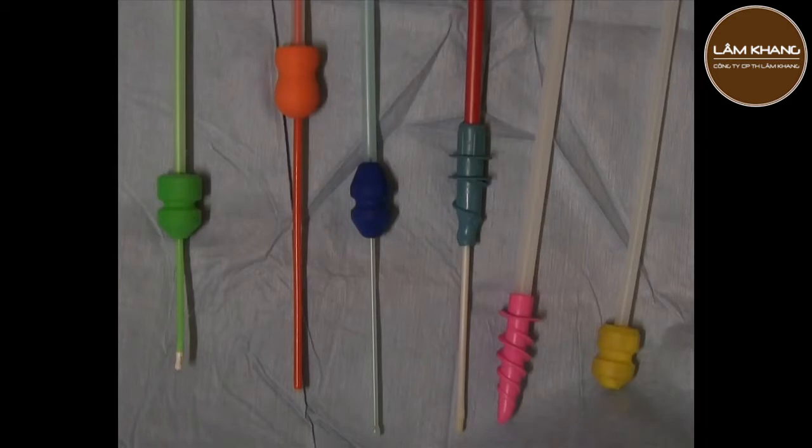Here's a picture of several of each type. These two are traditional AI catheters, a foam tip and a spiral tip, designed to deposit semen in the cervix. The other catheters on the screen are several commercially available PCAI catheters designed to deposit semen into the uterine body. You can see that these catheters look similar to the traditional AI catheters, except that they have an inner catheter which extends beyond the foam or spiral tip.